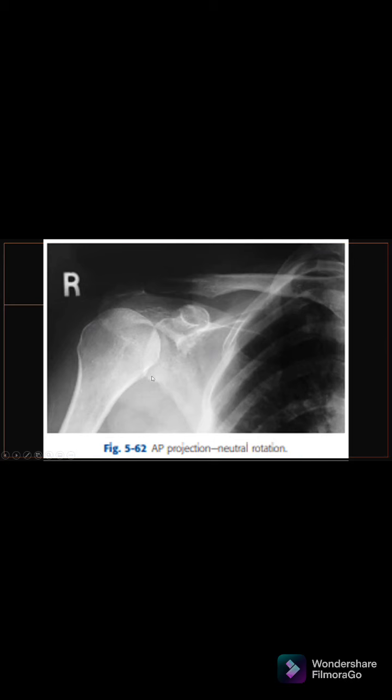Yan ang buong scapula. Makita rin siya. The lateral aspect, middle aspect, may konting outline siya dito banda. Nasusuperimpose ng ribs.